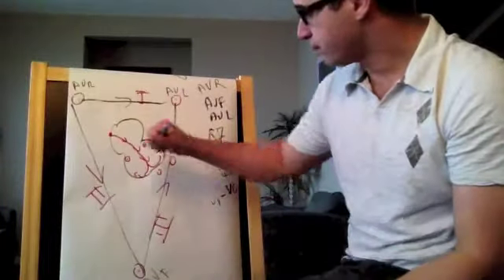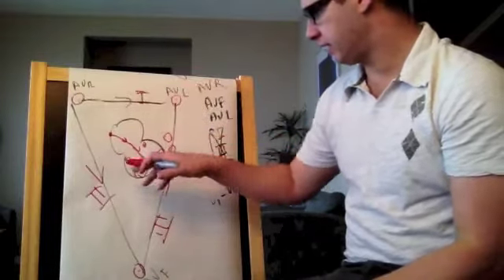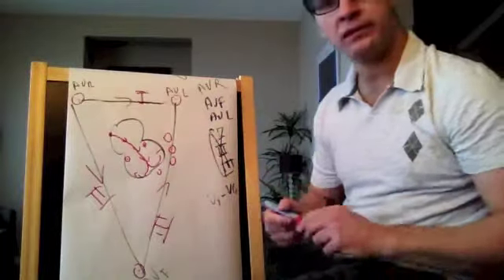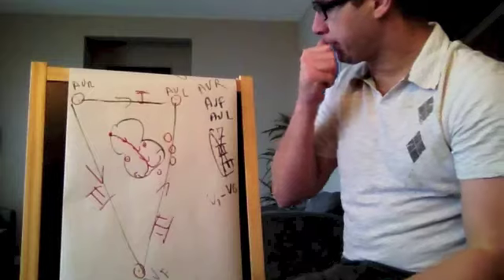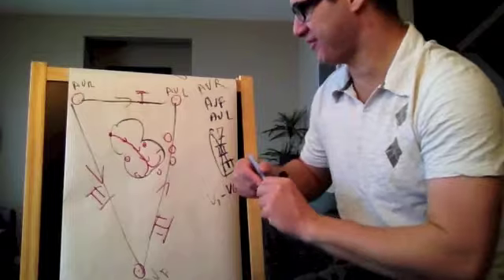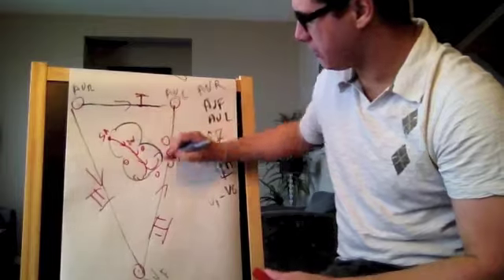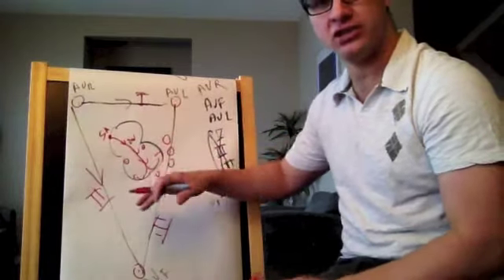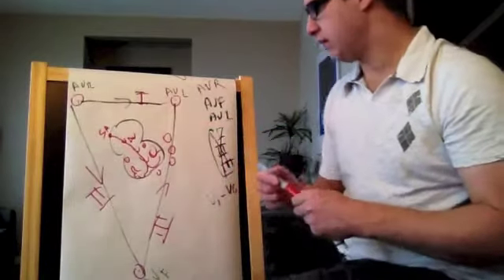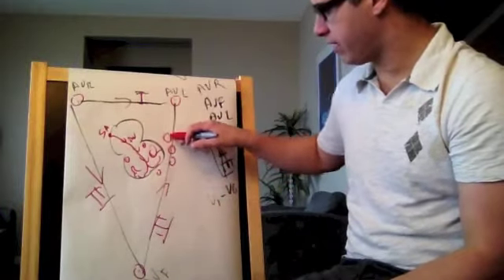Okay, part 2. So we were just talking about AVR, AVL, and so now we're going to talk about the V1 to V6 and how the electricity is going. And I told you it's going to be, so it looks like it's going to be a 3-part now. Maybe more, who knows. So basically we have our SA node, we have our AV node, we have the Purkinje fibers and everything, and then we have the right and then the left branch. So V1 is right over here, V2, V3, V4, V5, V6.